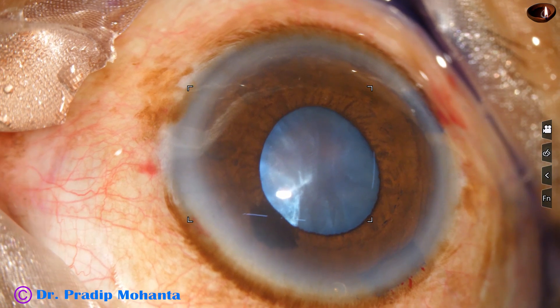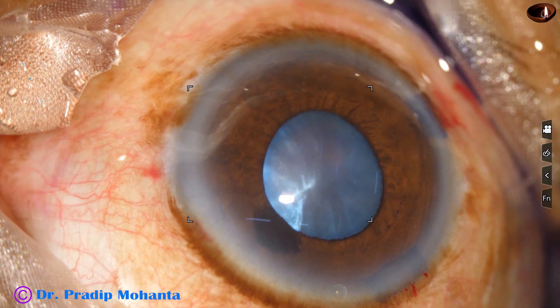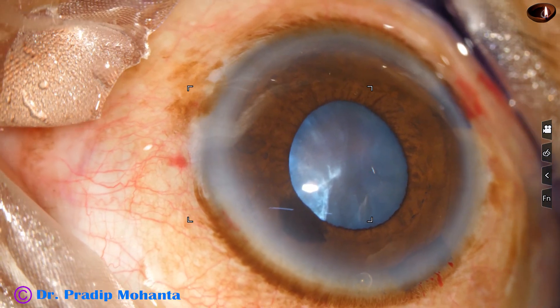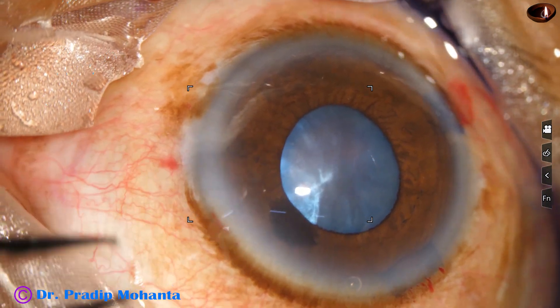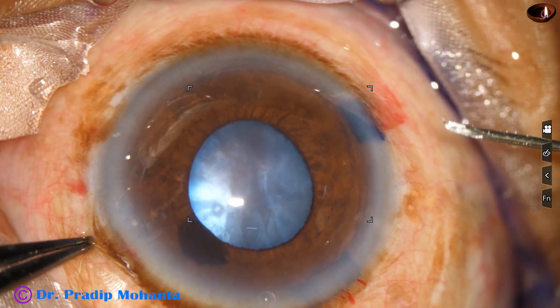So my plan is to make a small rhexis, aspirate some cortex, make the chamber deep, and then apply a pupil expansion device.